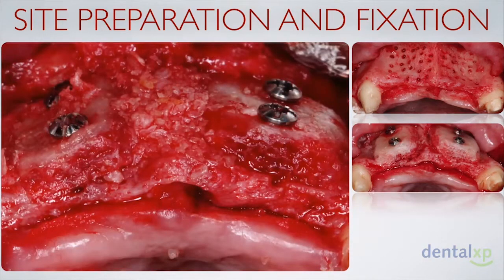We used 2-point fixation for both blocks in an attempt to minimize any micro movements or any interruption during the healing process, which may lead to infections or lack of integration of those blocks. Any sharp edges were removed and the block was contoured to have a smooth border, and the irregularities or deficient sites were packed with mineralized bone allograft to further restore the contour in between both blocks.